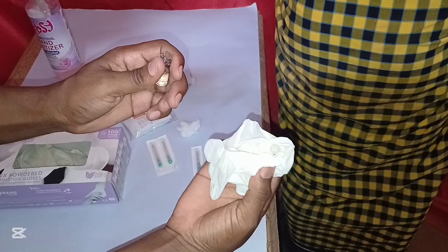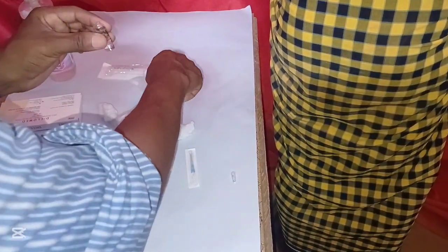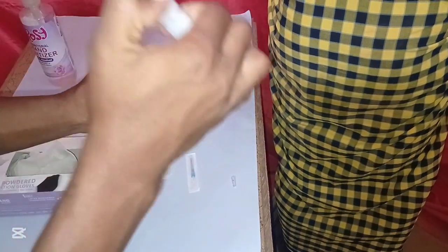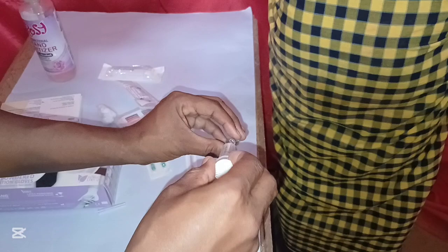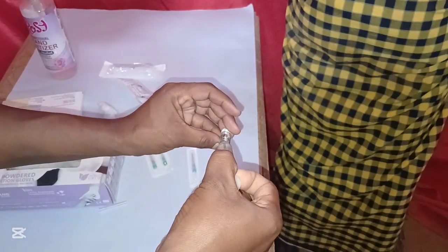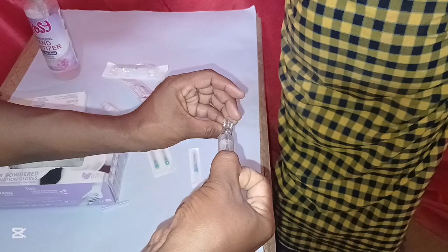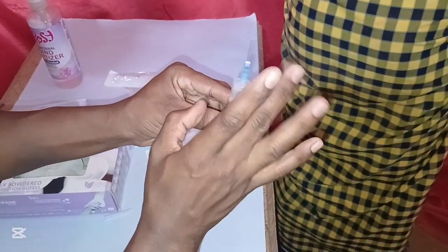This is how you are going to break the ampoule. Then get the syringe, remove the cap of the needle, withdraw the drug from the ampoule, and make sure you remove any air bubbles first.